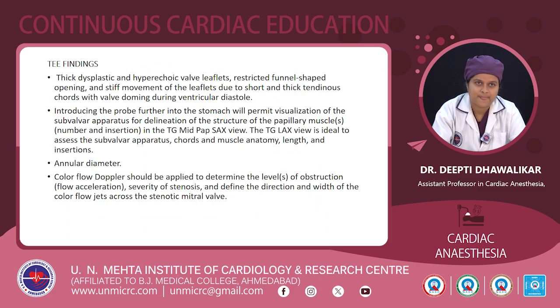So now, coming to TEE findings, they basically consist of thick, dysplastic, and hyperechoic valve leaflets, a restricted funnel-shaped opening of the mitral valve, and stiff movement of the leaflets due to short, thick tendinous cords, with valve doming during ventricular diastole. Introducing the probe further into the stomach will permit visualization of the subvalvular apparatus for delineation of the structures of the papillary muscles in a transgastric mid-papillary short axis view.